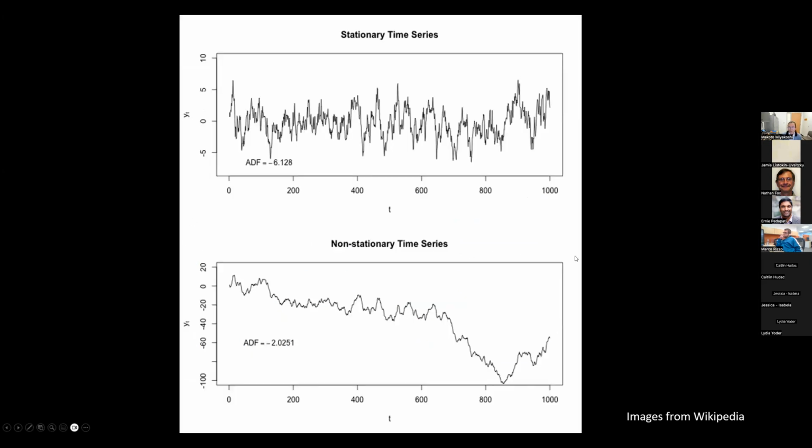This is also from the Wikipedia figures. The plot above shows an example of stationary data, and the data shown in the plot below is an example of non-stationary time series data. So that is a bad signal, and as EEG researchers, we can agree with these good and bad definitions, right? Because in the lower plot, we would say, oh, this looks like a Bereitschaft potential that develops over like 2 seconds. So we want to apply a stronger high pass filter or something like that. Intuitively, we can tell that, right?